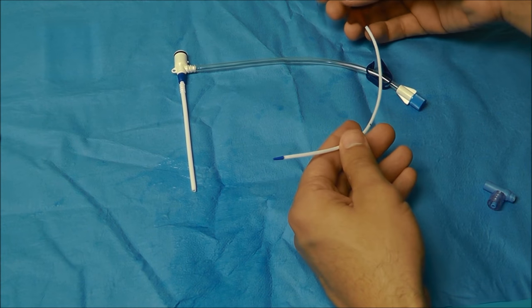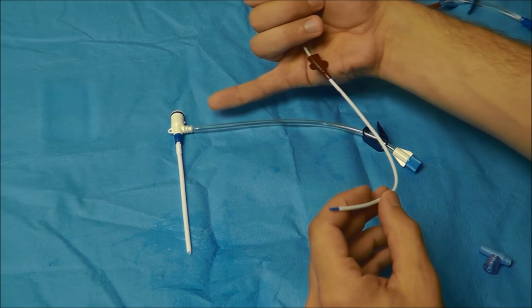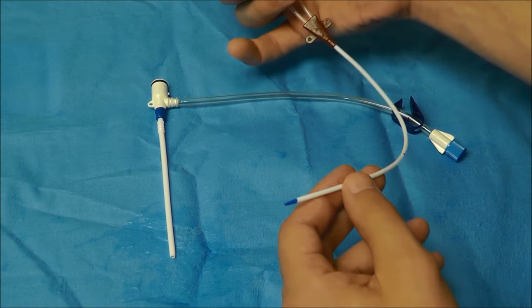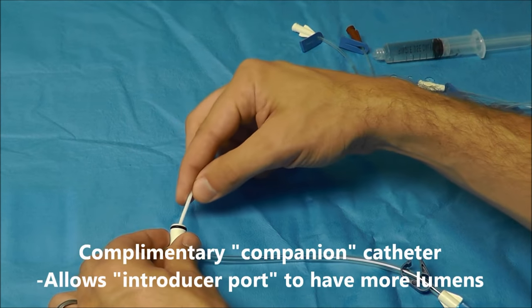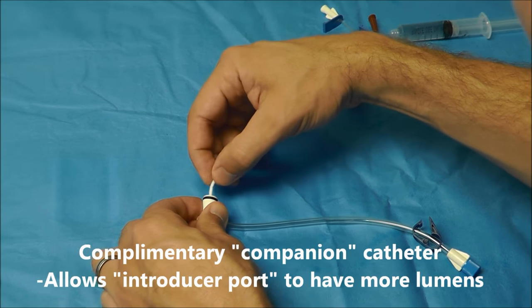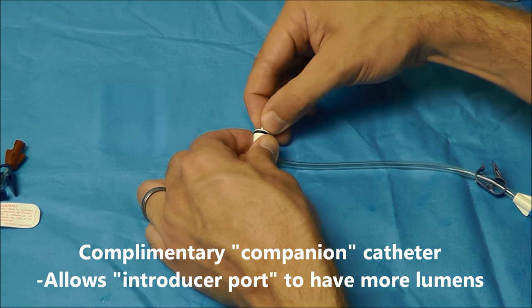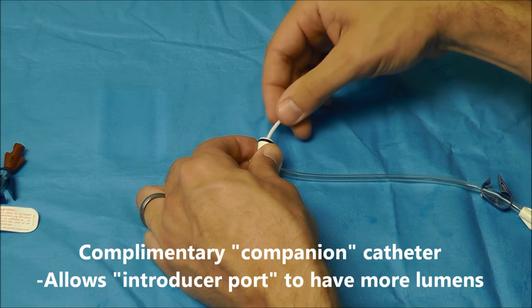The other option that you have to give you more ports when you're using a central catheter with an introducer port is to use what's called a companion catheter, and it's just like a regular central line catheter except you advance it down here and you're just going to be able to have extra ports.